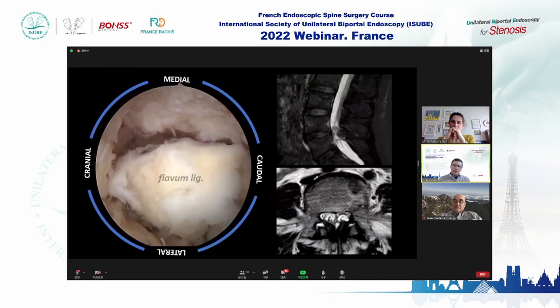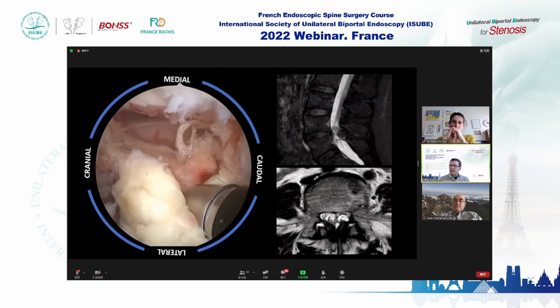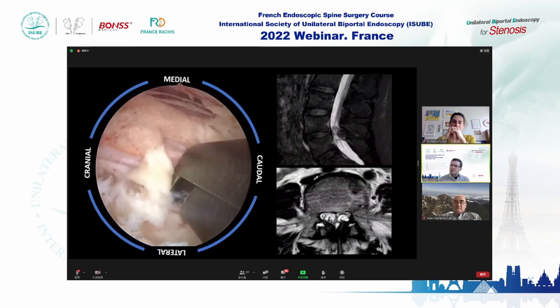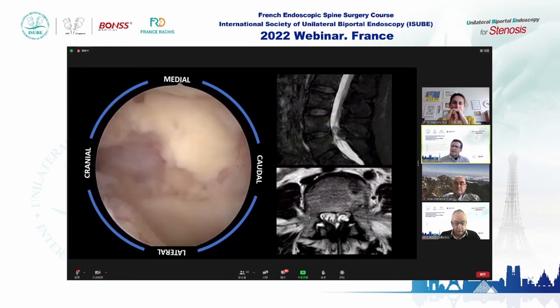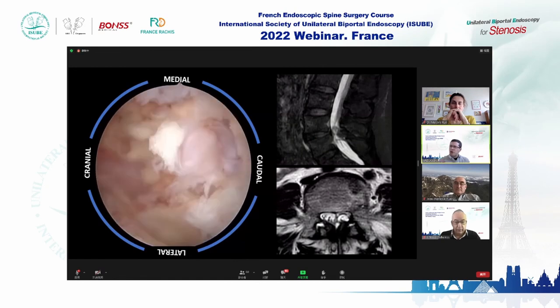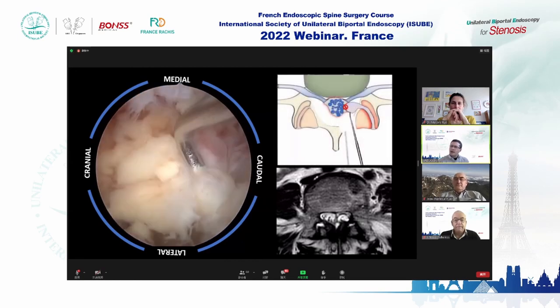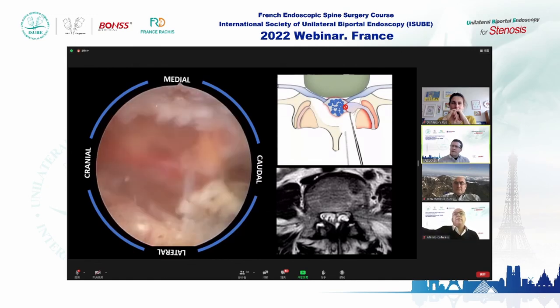The final target is that the flavum ligament is floating in our surgical view. Now we feel comfortable to detach the cyst — it is very strongly attached. We are now detaching all the epidural fat. After that, we remove the flavum ligament. In this case, the cyst has very strong walls attaching to the dura. We are lucky in this case — we don't have any problem with the dural tear.